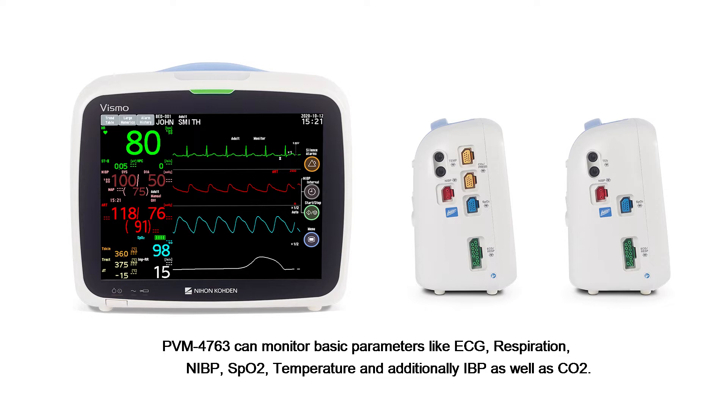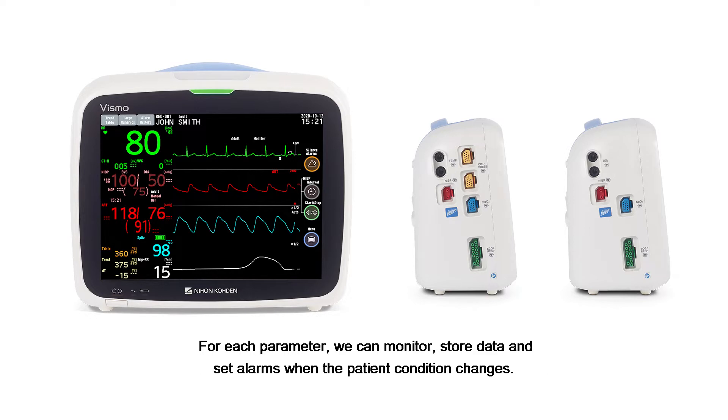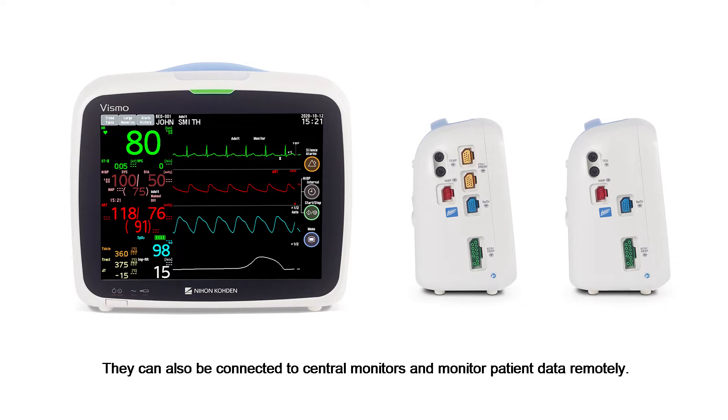PVM-4763 can monitor basic parameters like ECG, respiration, NIBP, SpO2, temperature, and additionally IBP as well as CO2. For each parameter, we can monitor, store data, and set alarms when the patient condition changes. They can also be connected to central monitors and monitor patient data remotely.